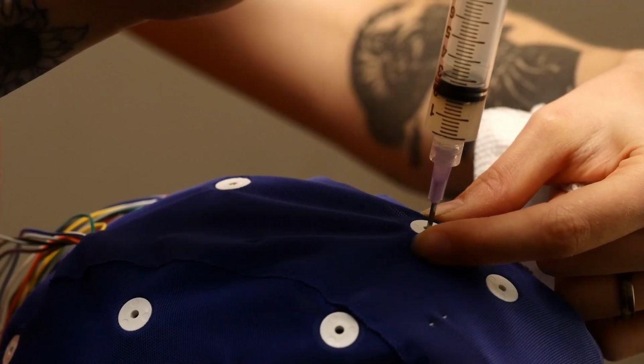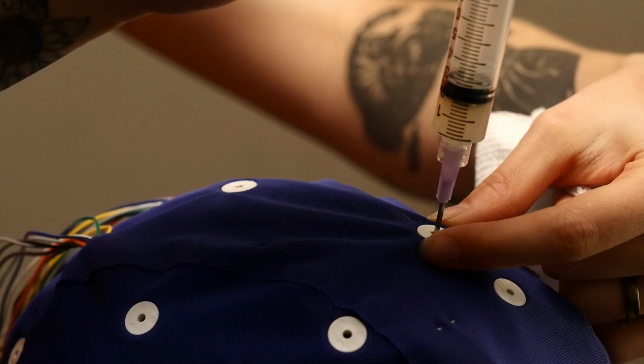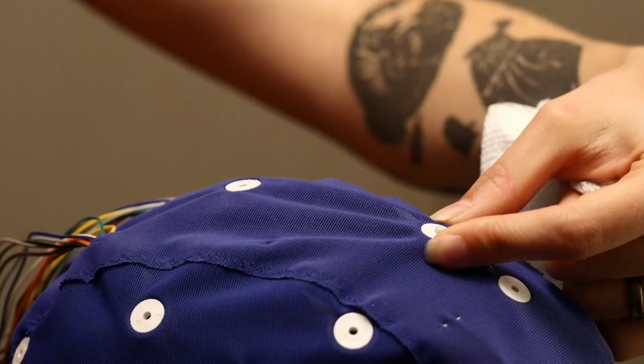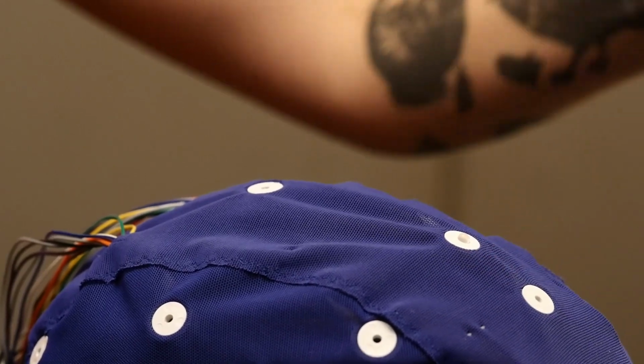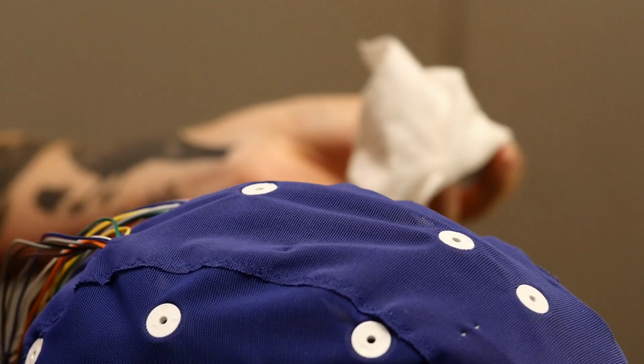It's a tiny amount. That's going to give us a little bit of room so that when we inject gel into our cup, it is going to push out the excess air from the bottom. And then as we settle the electrode down onto the scalp with a little twist, it will encourage all the extra air out. We wipe, and that's it.